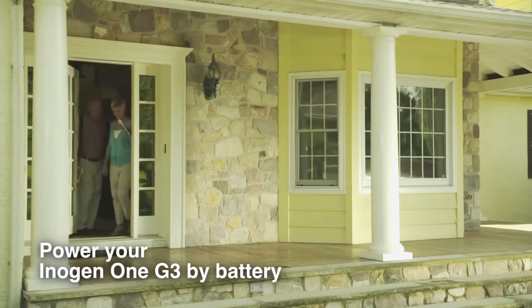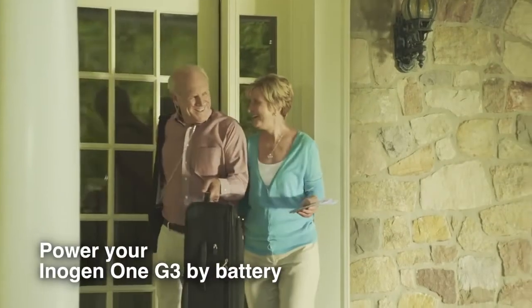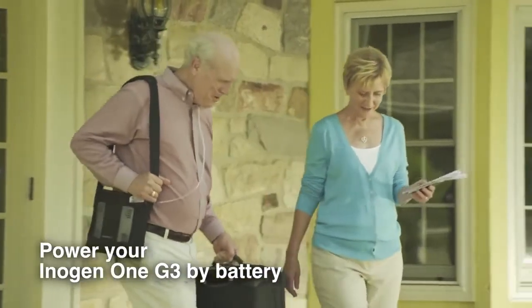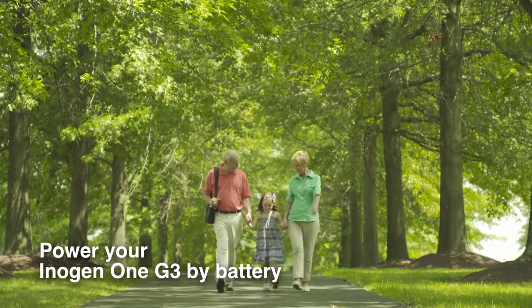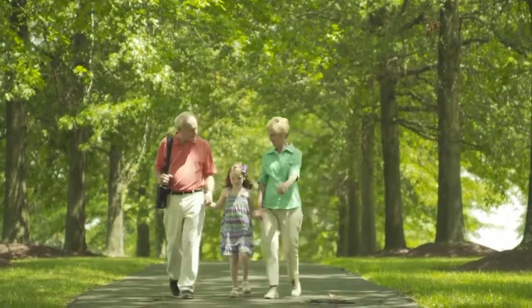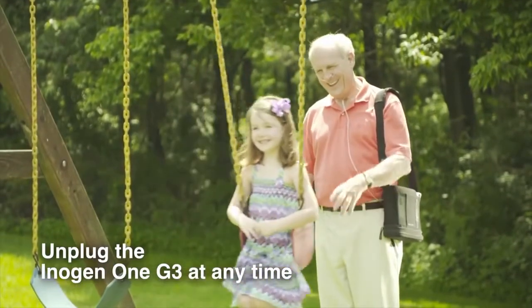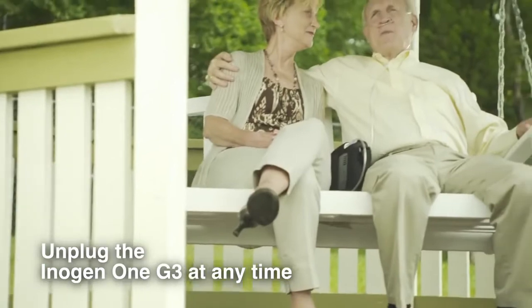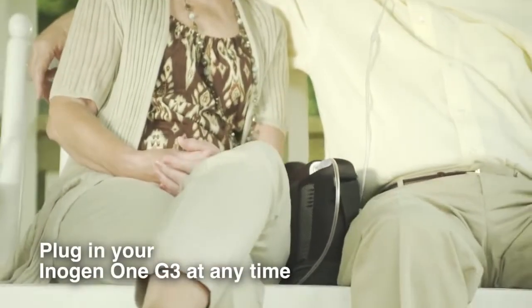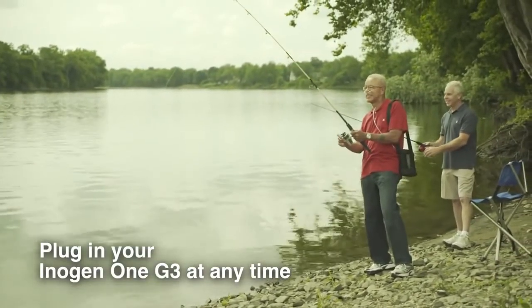You can power your Inogen One G3 just on battery power, from any wall outlet, or in your car. Whenever your Inogen One G3 is plugged in and a battery is attached, you are recharging the battery. An empty battery may take up to 4 hours to charge, but you don't have to wait for it to charge completely. You can unplug it at any time. You can also plug in to charge the battery at any time. You do not need to wait until the battery is empty.